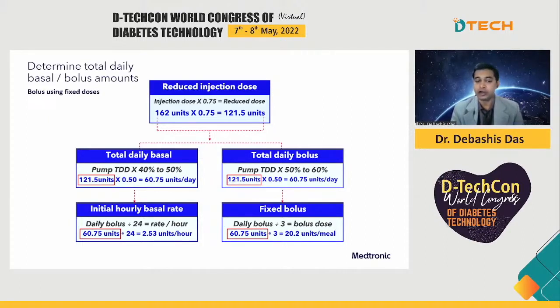And for the bolus, we recommend that everybody should do carb counting and use the bolus calculator, what the system recommends, and take it. A lot of patients, at least in India, and even my colleagues from the US who practice in Europe, also recommend a fixed bolus because patients are not comfortable doing carb counting.